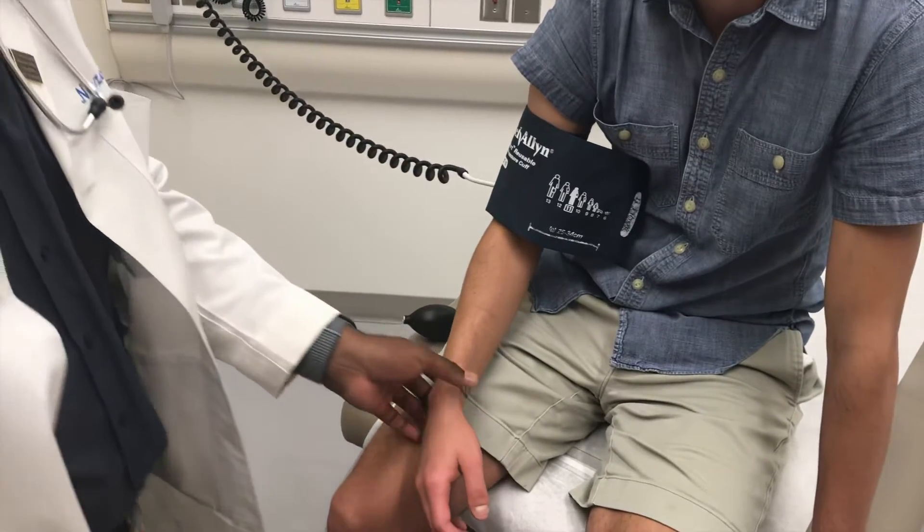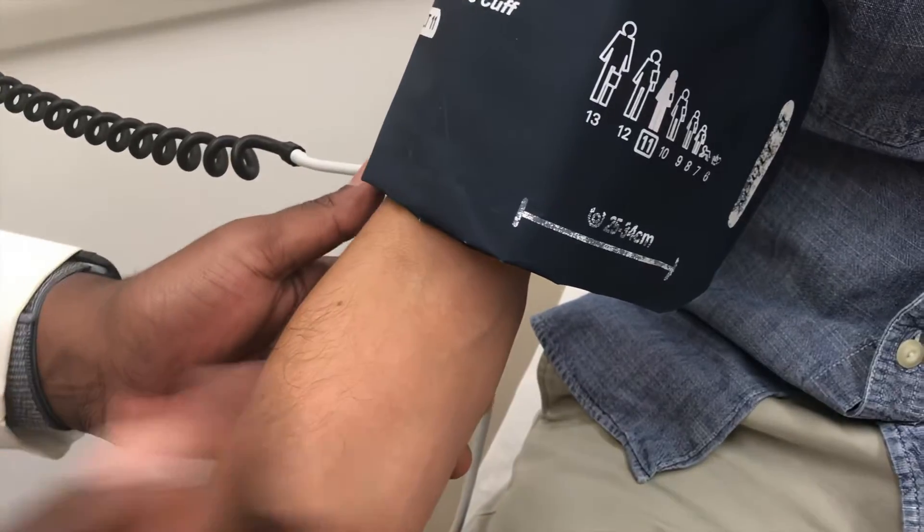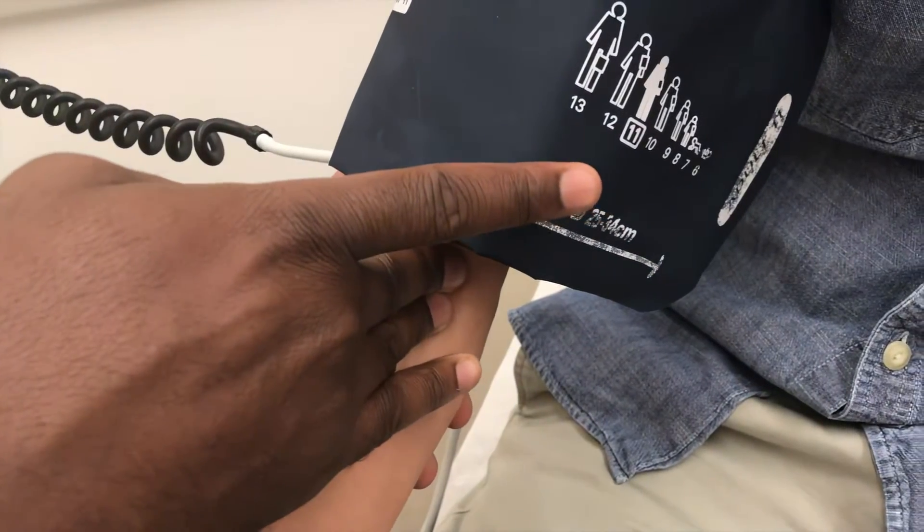In the second clip, you will see the demonstrator palpate the brachial artery pulse, located over the medial aspect of the antecubital fossa. The location where you palpate the brachial artery pulse is the same location over which you will place the bell of your stethoscope when you measure the blood pressure. Note here how the demonstrator supports the patient's arm and that the cuff is at the level of the heart. In this next clip, note where the demonstrator palpates the brachial artery.